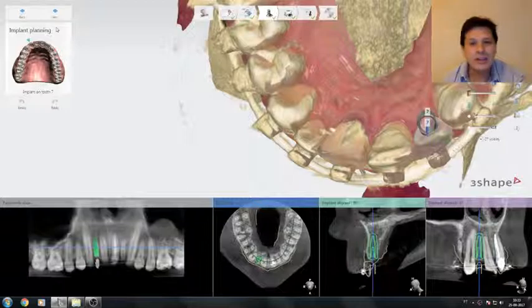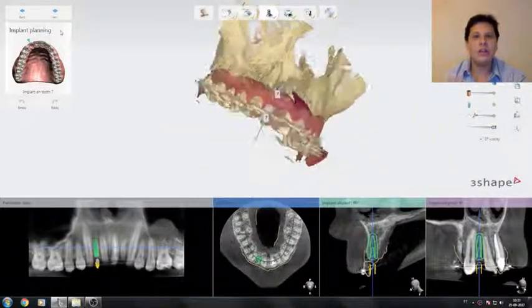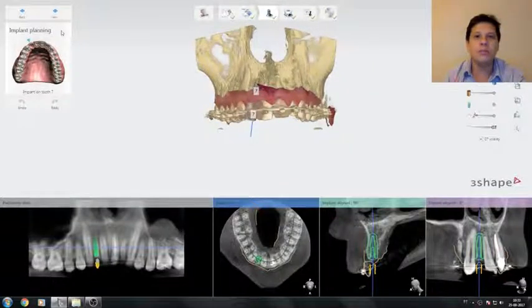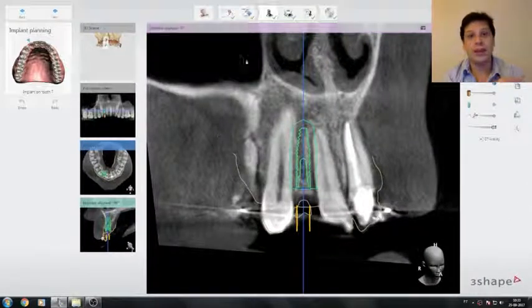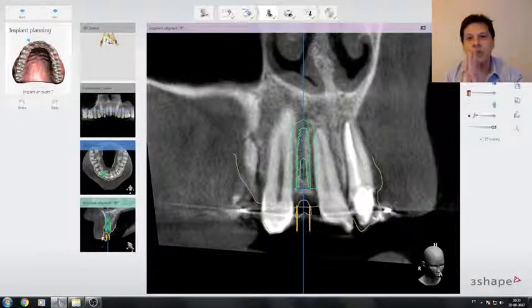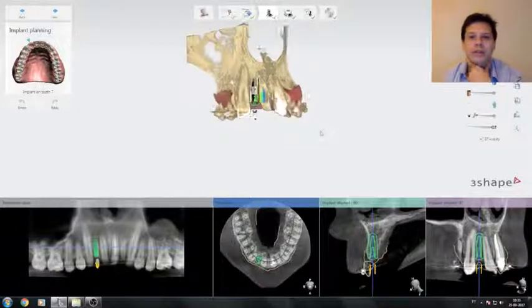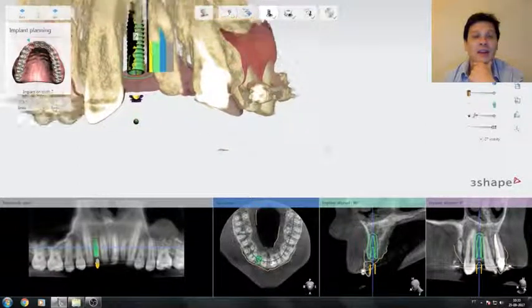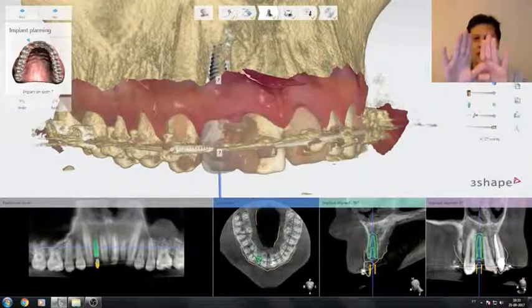Now, the lateral incisors normally represent that situation well. In orthodontic patients, you have two problems here. One is to take the impression, but that is solved, like I showed you in the case before, in that you can now do a digital impression and send it to the lab without taking a mold. The second is the correct position of the implant. How many times does the orthodontist take the patient to the implantology suite and say, is there enough room to place an implant? And normally the roots are tipping or you have a small diameter space.